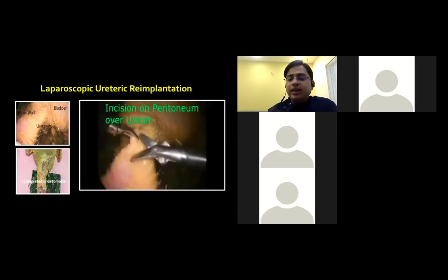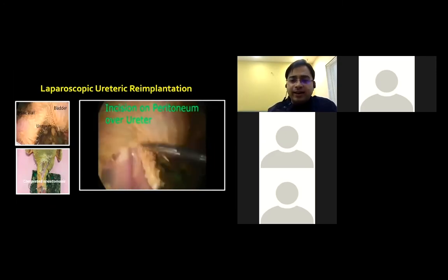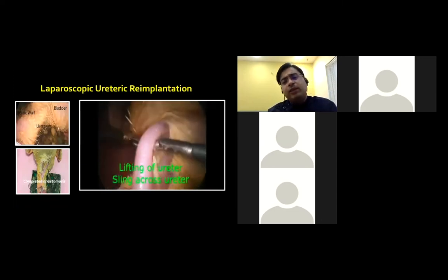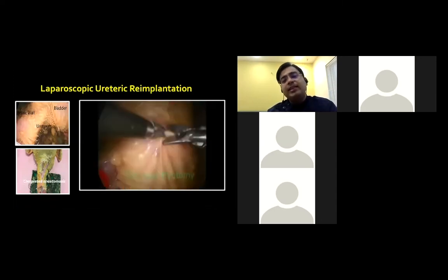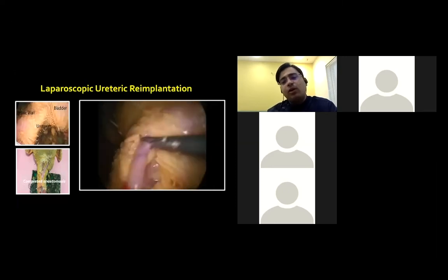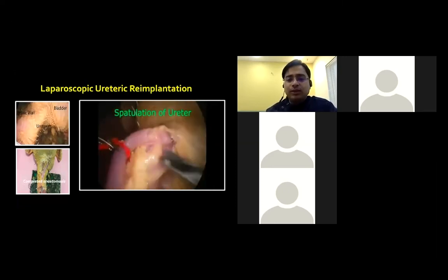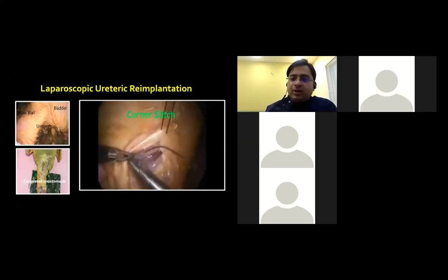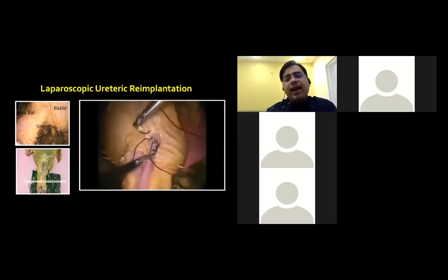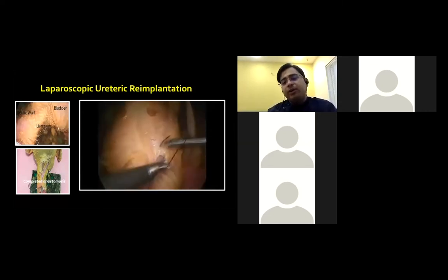Here the esophagus will mimic the ureter and the crop will mimic the bladder. Once you make the incision, it would be like a detrusor incision, and the bluish hue of the crop will represent the mucosa of the bladder. The hitch stitch that you have taken helps the crop hang and not empty when you are doing the procedure.